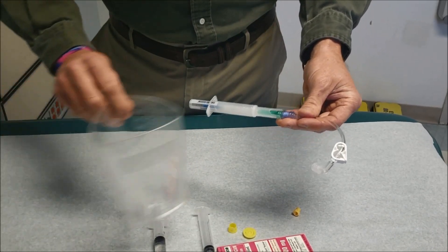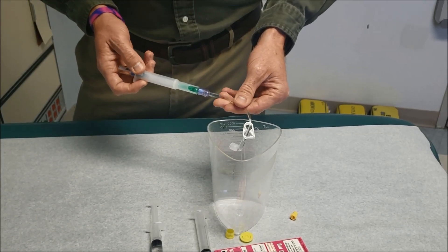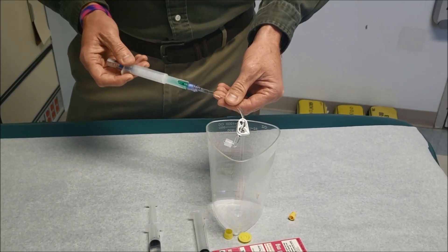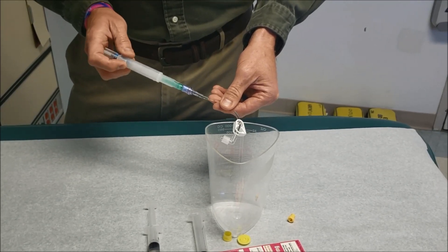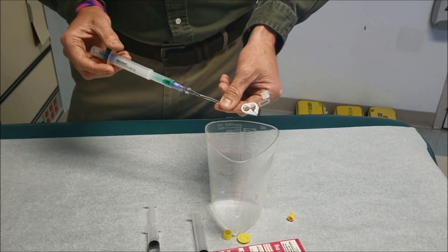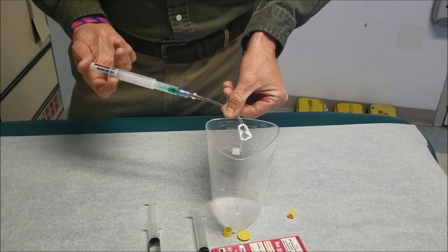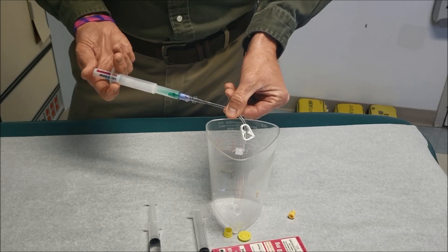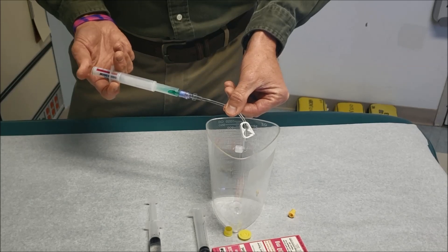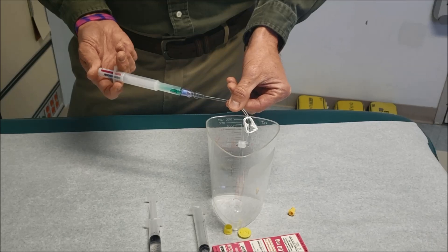After the needle's inserted, remember that we hook lidocaine up first to the conscious patient. We want to instill a total of 40 milligrams of lidocaine over two minutes, so extremely slow. Since you already have 1 cc in the catheter, you only want to push 1 cc out of the syringe at this time. Over one minute you're just going to slowly push to allow the lidocaine to soak into the bone to numb the area, where we're then going to do a rapid 10 cc flush following this lidocaine administration.